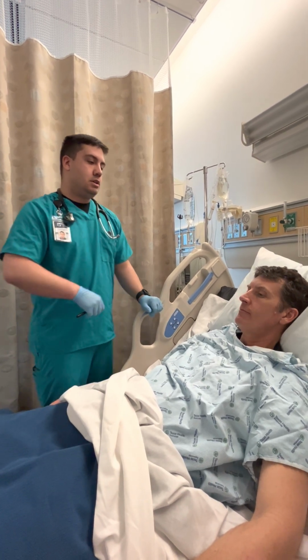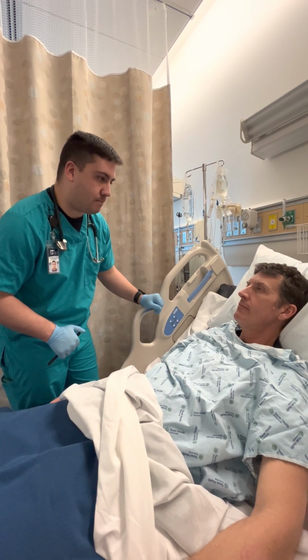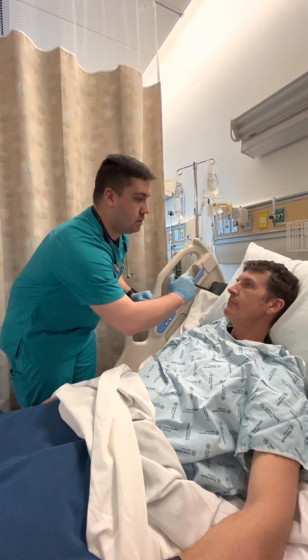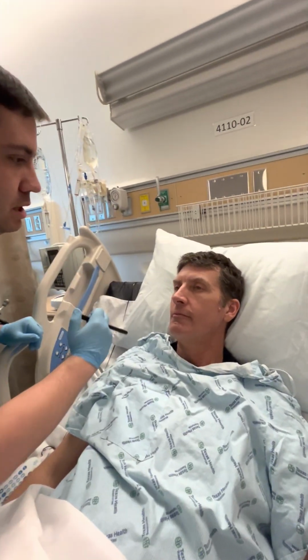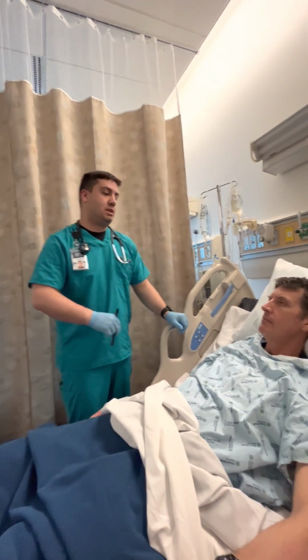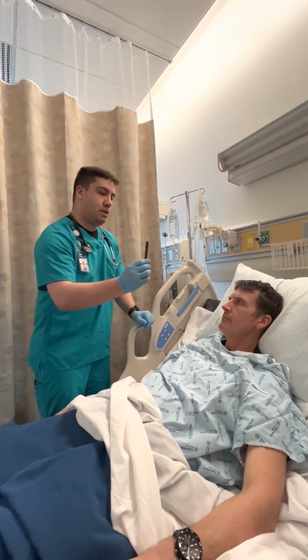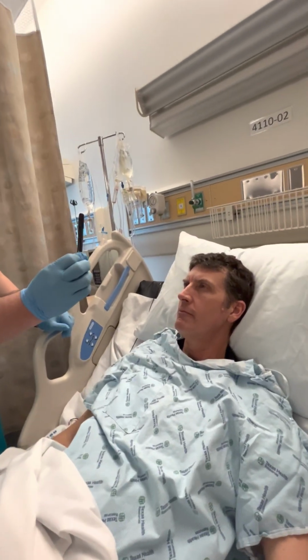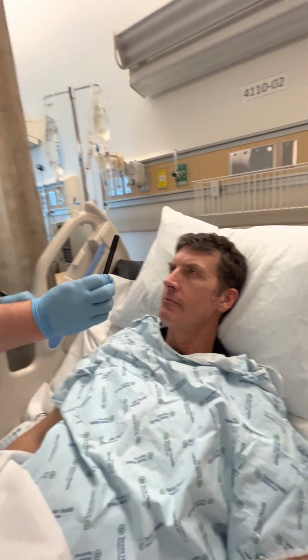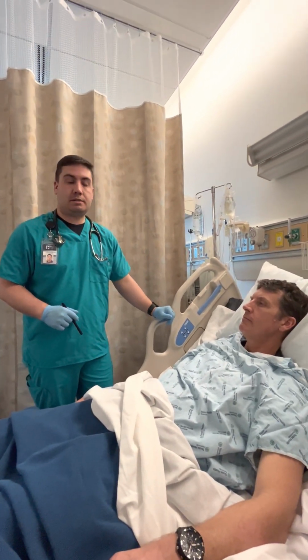All right. So I'm going to check your pupil response with a light. Is that okay? Mm-hmm. Okay. So I'm going to flash a light right here, right there, and we're going to flash another light. Okay. My patient's pupils at this time are equal, round, and reactive to light. So I'm going to have you follow the tip of my pen light with just your eyes, okay? And now I also have accommodation for my patient's eyes.